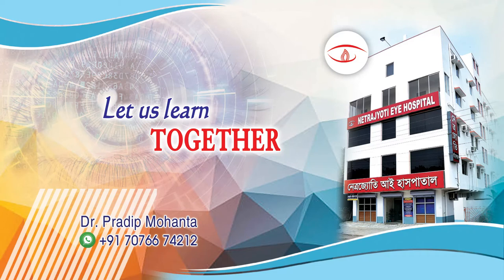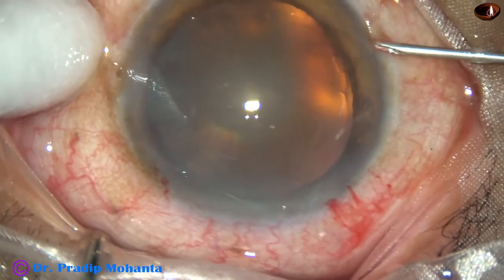Friends, welcome to my workplace at Ranaghat, West Bengal, India. In this video I want to show mechanical chop.